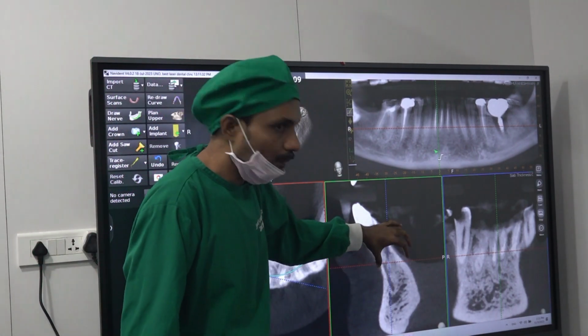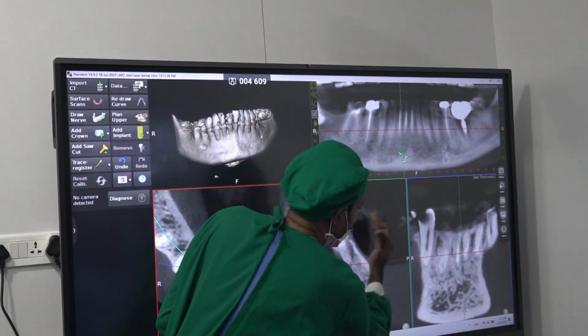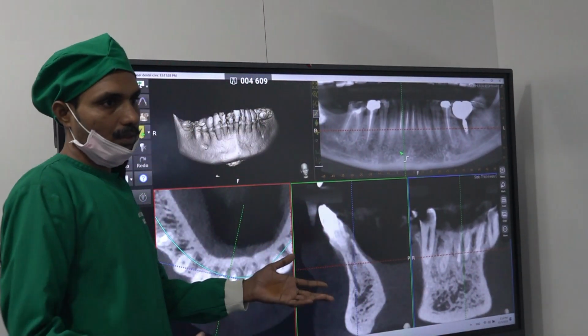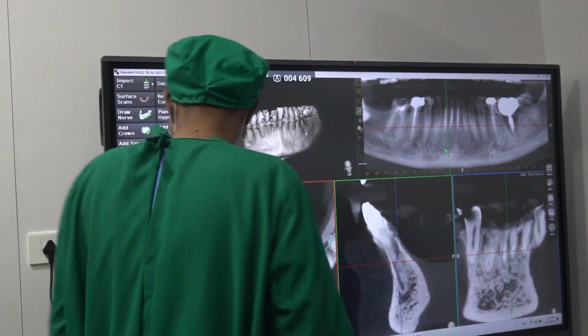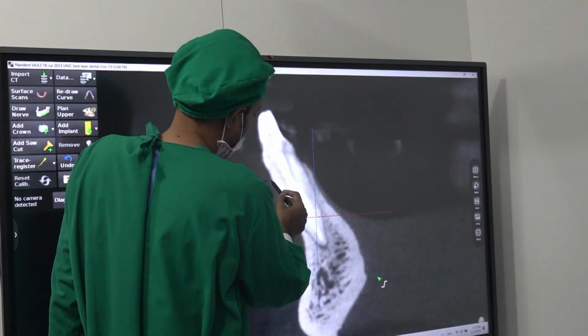So what we are doing is bone building surgeries. So you have to add bone here. You have to open the flap fully here and fully here. Now we will see the lateral incisor. See the shape first, as I told. See the outline first.